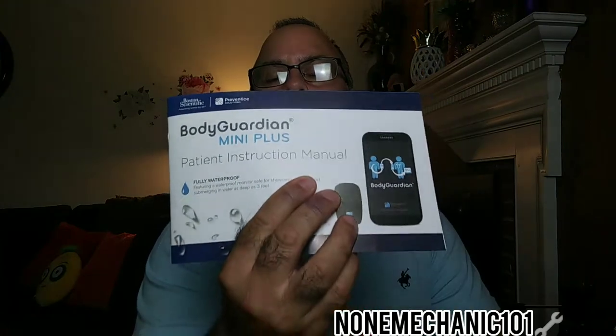Also during this video I'm going to take off my shirt, and the reason is only so you can see where the heart monitor is located. So if you don't want to see a hairy chest, just fast forward a few minutes. The heart monitor I have on is called the Body Guardian Mini Plus.